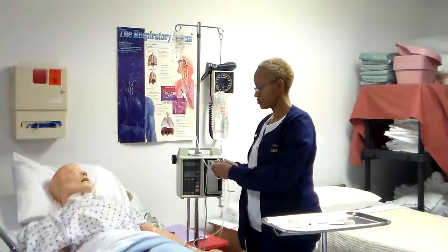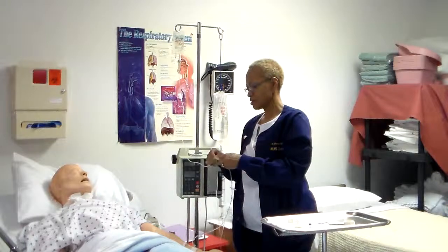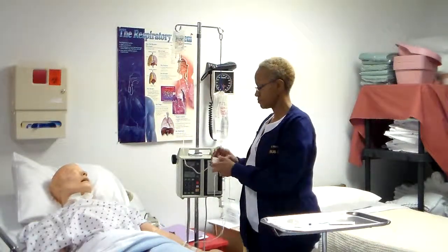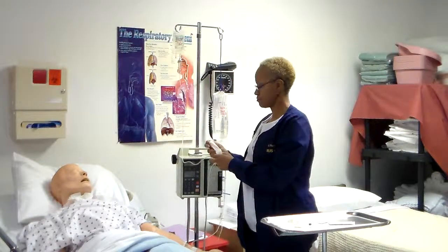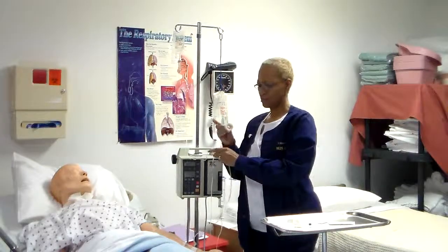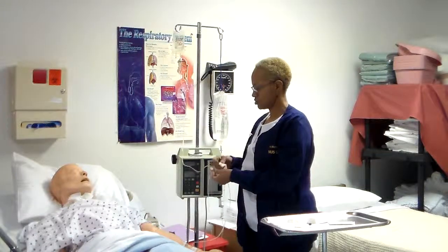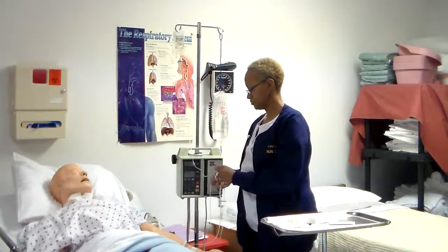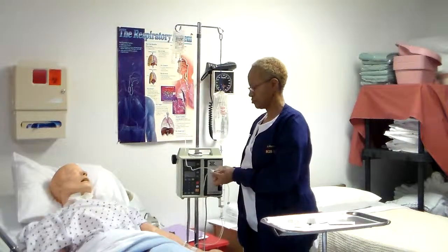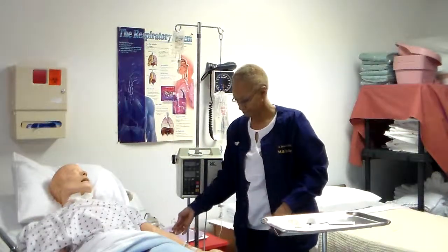And then the third way, tubing port. Wipe off port, then connect sterile needle to end of piggyback or tandem infusion tubing. Remove cap, cleanse injection port on main IV line, and insert needle through center of port. Secure by taping connection. Tape it, secure. I just used a needle, or you can use a needleless system, so it's taped in place.